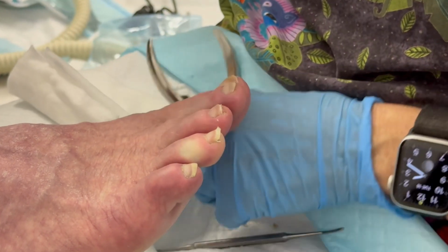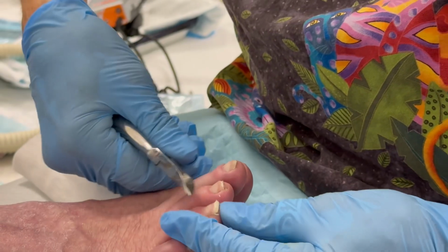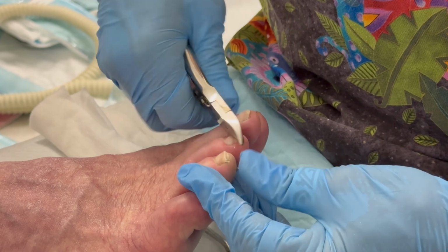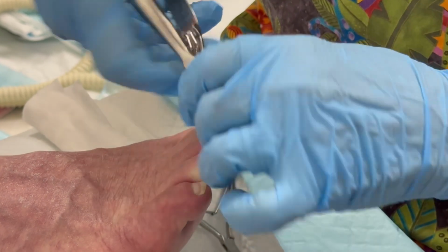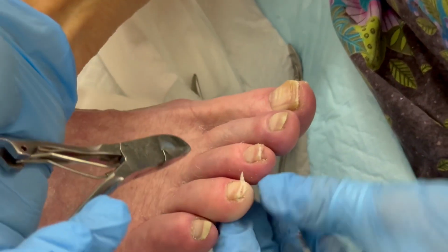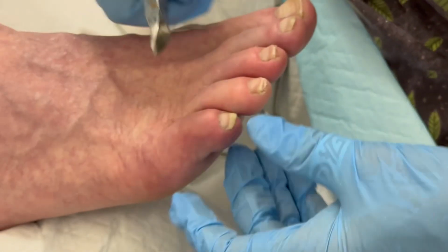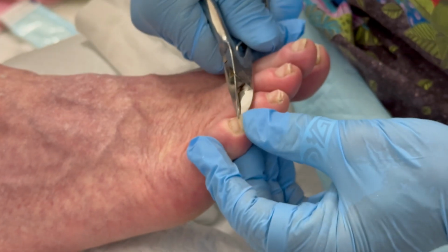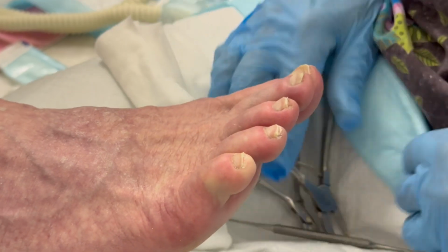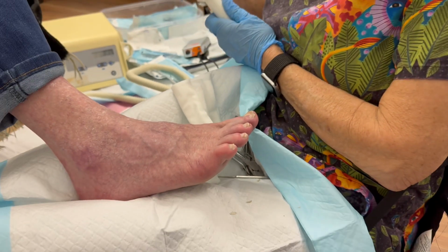Oh, that's actually a little bit too thick for these small guys, so I'll go to these, and I like these little curved ones. They just fit my hand. If you're a guy or a big woman or somebody with bigger hands, you have to fool around and try different things. I'm doing the, whatever I call this maneuver, the reverse maneuver. Up the inside. Okay, and then I will smooth across with this guy. Oh, those little toes haven't had such love and treatment for so long.